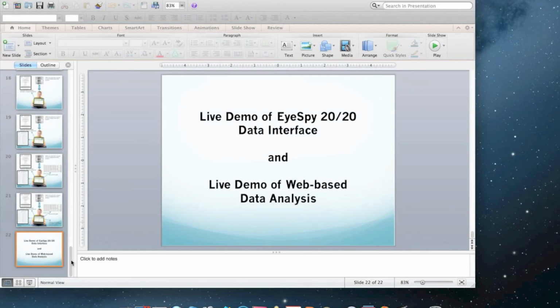As far as the protocols in which the data is collected and then either exported or reported to various agencies, that's all relatively easy to do. I don't want to understate the value of it, but once you're collecting the data, that's the hard part.